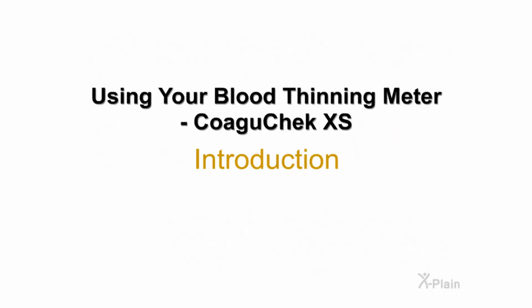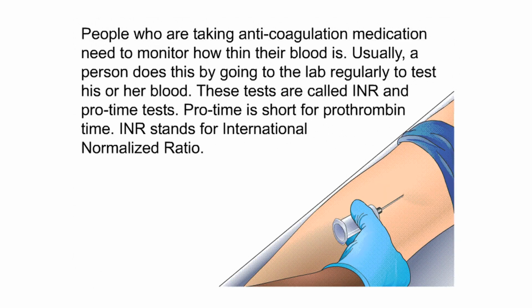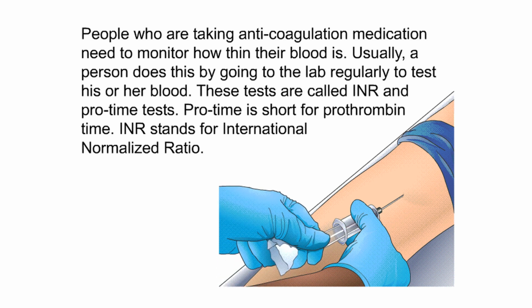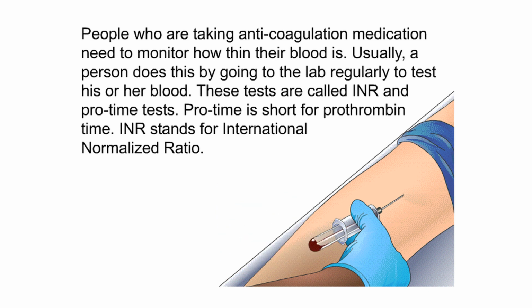Using your blood thinning meter, CoaguChek XS. Introduction. People who are taking anticoagulation medication need to monitor how thin their blood is. Usually, a person does this by going to the lab regularly to test his or her blood. These tests are called INR and ProTime tests. ProTime is short for prothrombin time. INR stands for International Normalized Ratio.